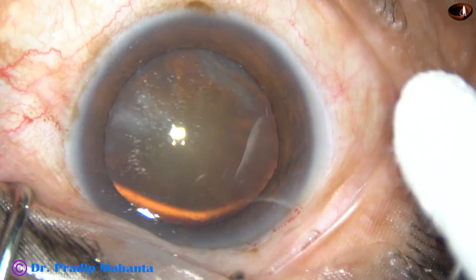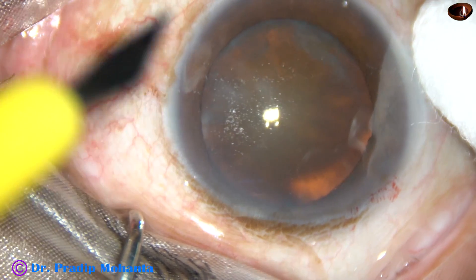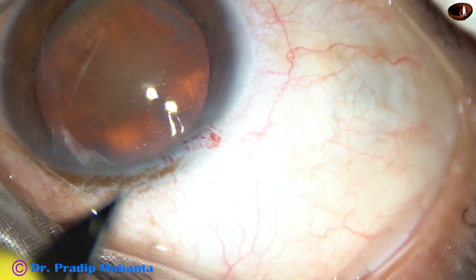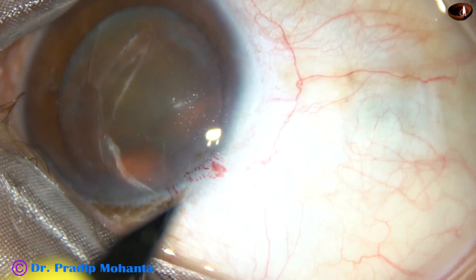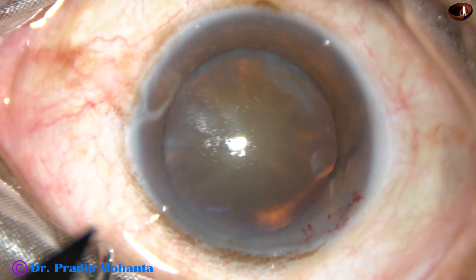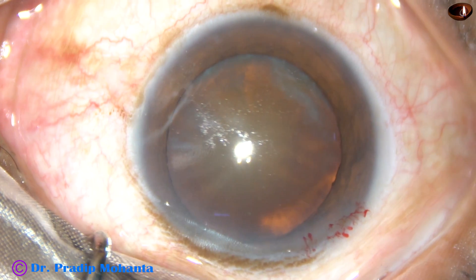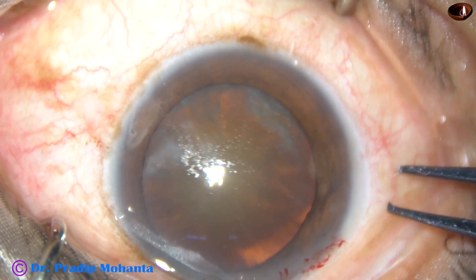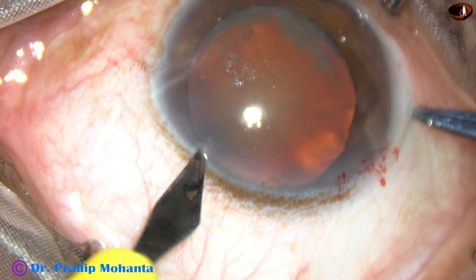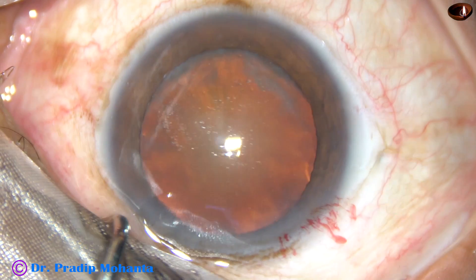By this time, the main incision has been made. Now I am trying to make a side port. The patient is moving his eye a lot — the patient is under topical anesthesia. When you see the patient is not able to cooperate, take a tooth forceps, hold just behind the limbus, fix the eyeball and then make the side port.